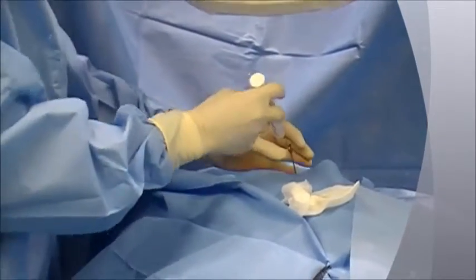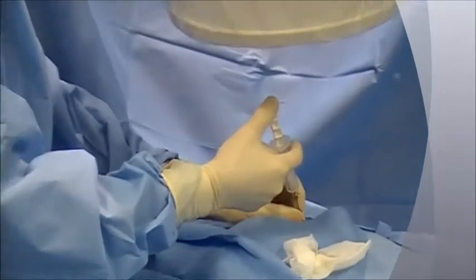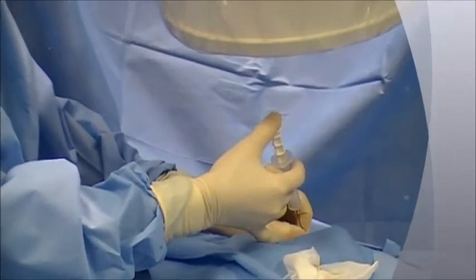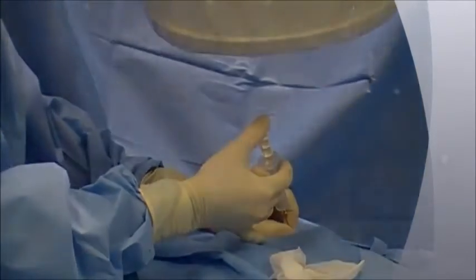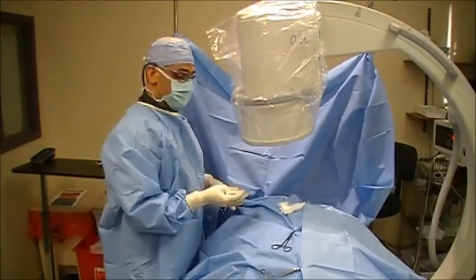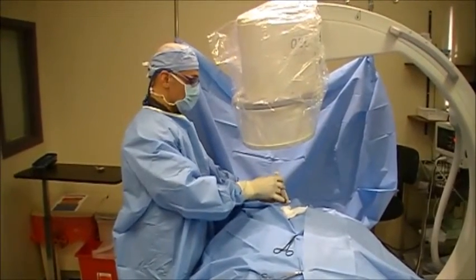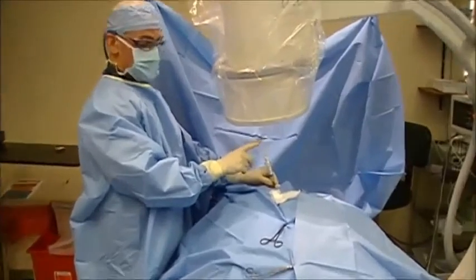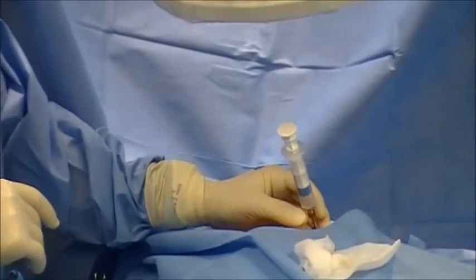There's a lot of resistance here because I'm on what's called the ligamentum flavum, but then as I gently advance it I'll feel a loss of resistance. I've advanced the needle approximately three millimeters and encountered that loss of resistance. As you can see, it's now extremely easy to inject air, indicating correct placement of the needle in the epidural space.